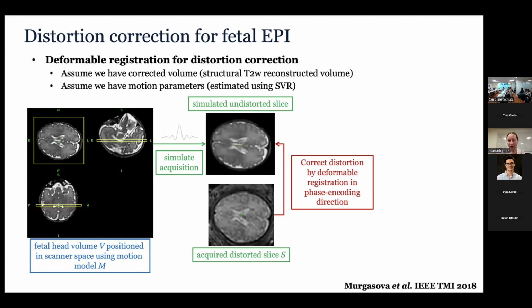And it's actually a very special registration because we're registering 3D images, but only in one direction. And it's very important to constrain it because the contrasts are not exactly the same, and you would get lots of artifacts in your deformation field without it. And the second constraint is the Laplacian constraint. So we smooth the field with the Laplacian.